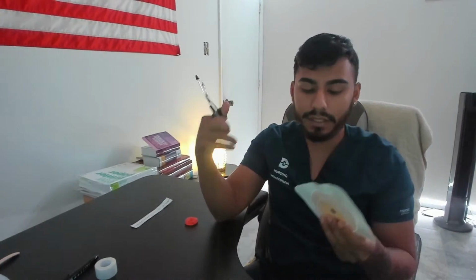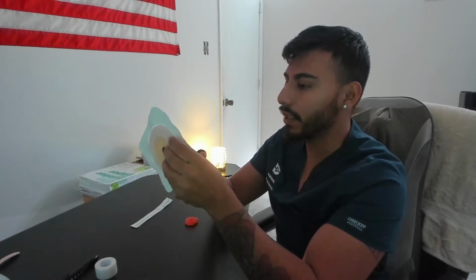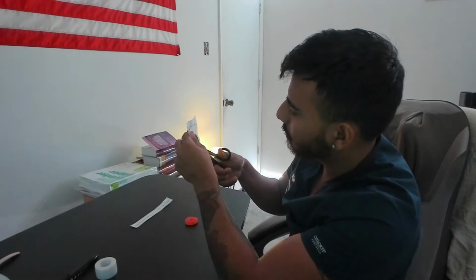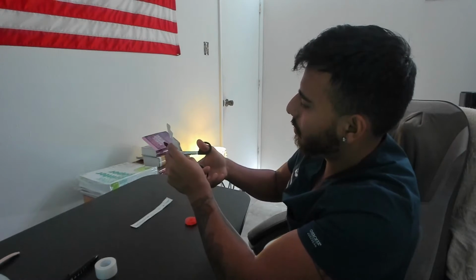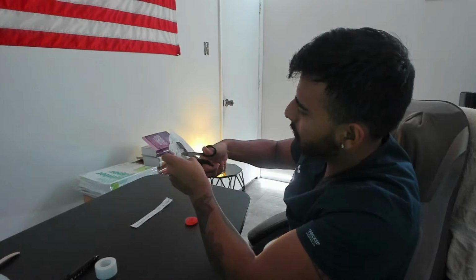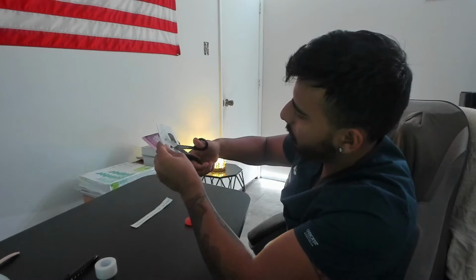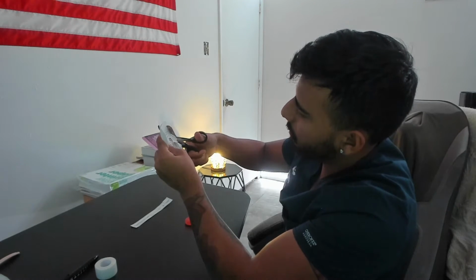So I go ahead and get my scissors. Again, I'm using the scissors that I got from school. These are kind of bulky, but I've got to do my best. So I'm going to cut right down the middle. Okay. Cutting along the line.